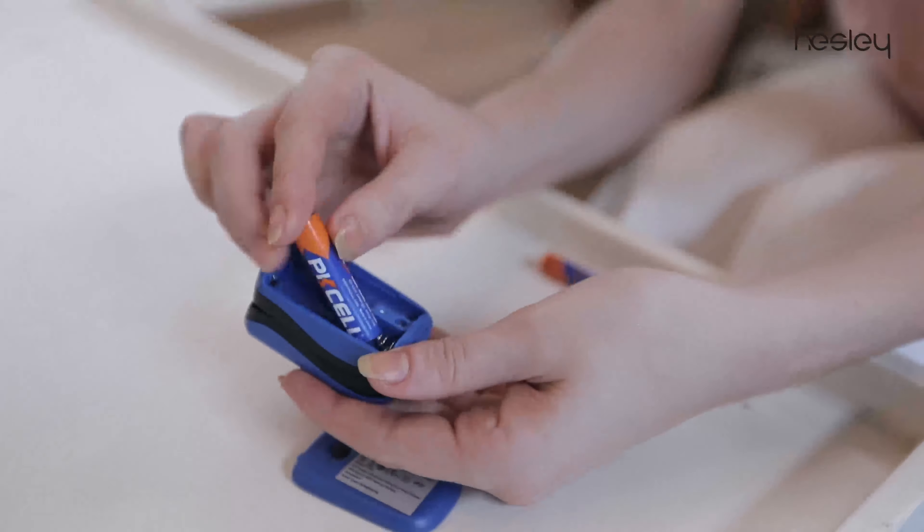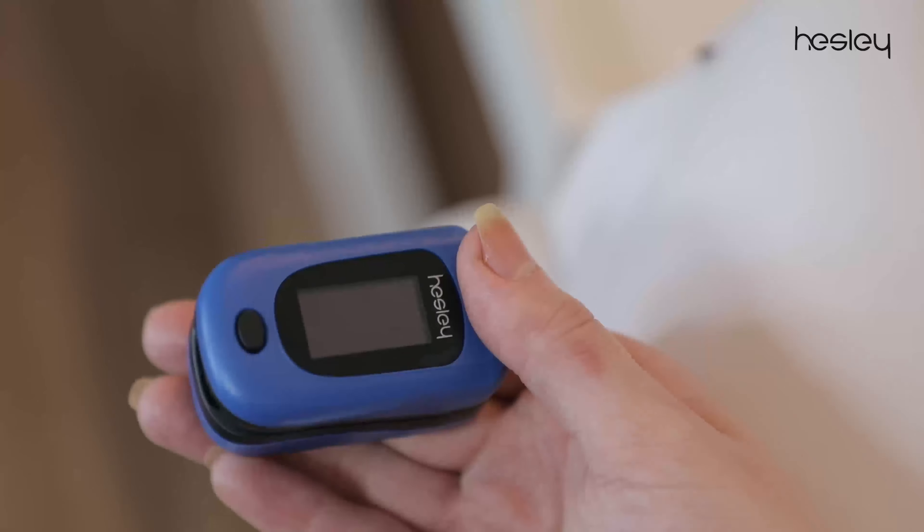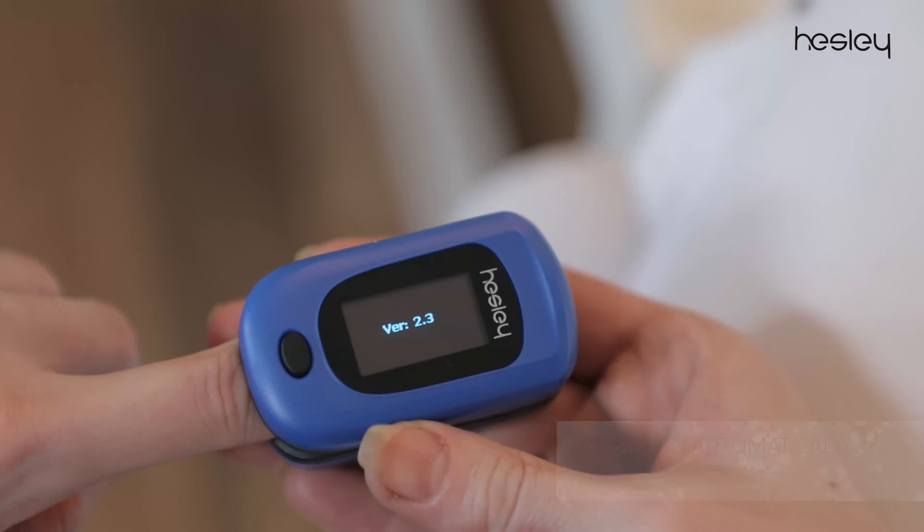To get started, insert two AAA alkaline batteries that come along with the device. Press down the end of the clip and gently place your index finger of the left hand in it.